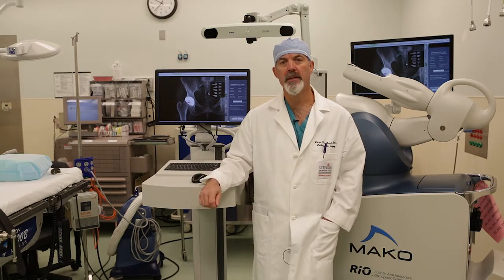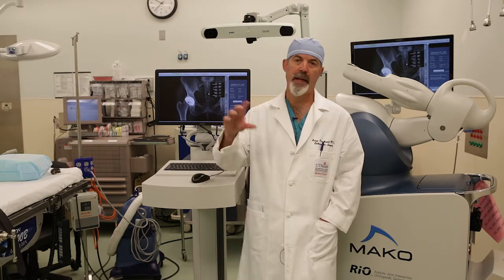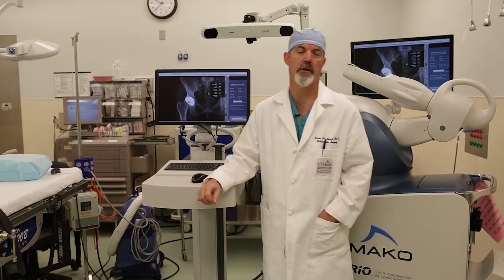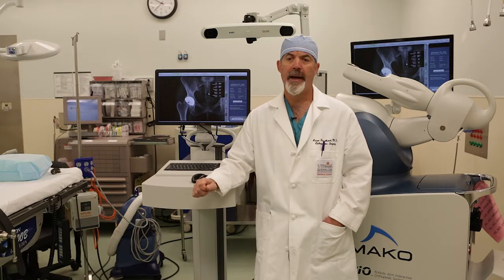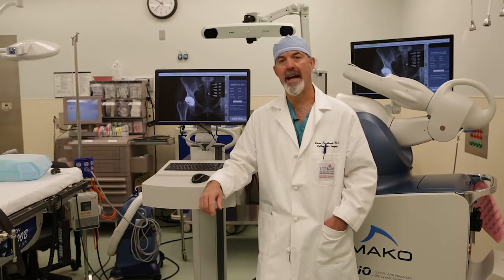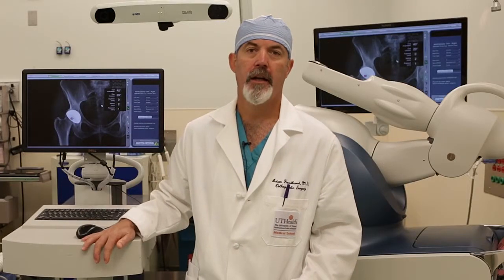When we're doing hip replacement and knee replacement with conventional instruments, it's kind of like pinning a miter box, which is a small cutting jig, onto the knee pieces or onto the hip pieces, and then reaming away or cutting away the bone. And those cutting instruments have a certain domain in which they work, which has to be controlled by the surgeon. With robotic surgery, you can only cut within the areas that you have planned.